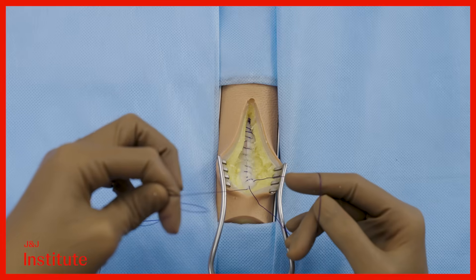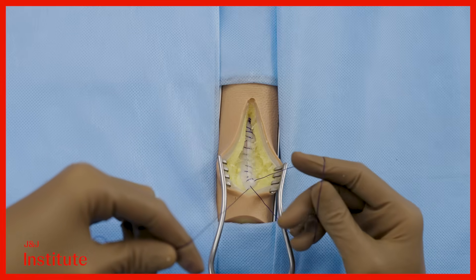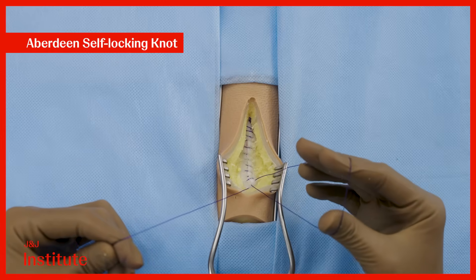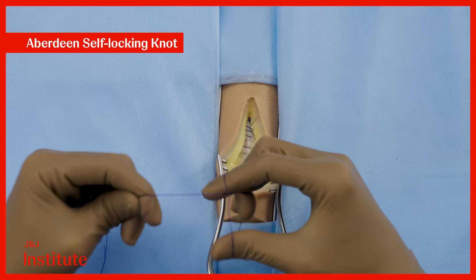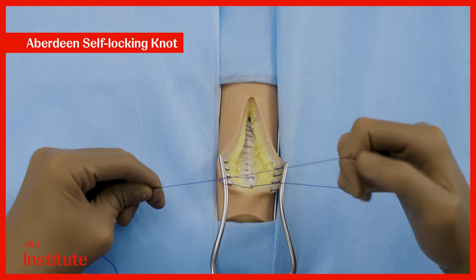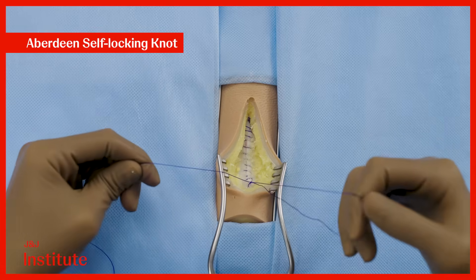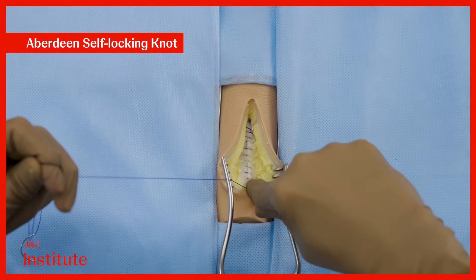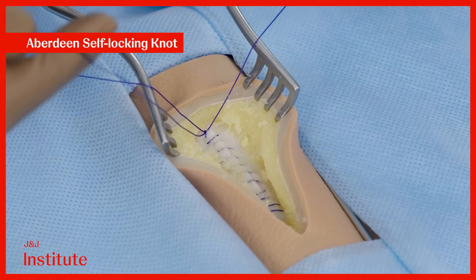When you have finished suturing the length of the incision and you have arrived on intact fascia, we can now complete the closure with the help of an Aberdeen self-locking knot. Pass the long end of the suture through the last loop and tighten the knot by applying traction with the right hand. Utilize the base of this hand to ensure that the knot lies flat on the fascia.